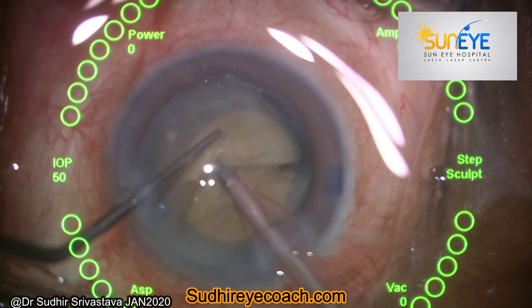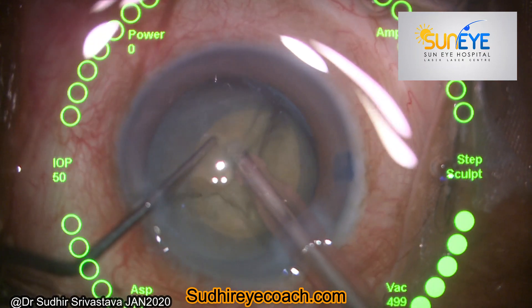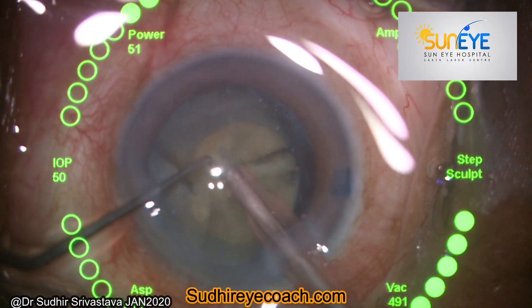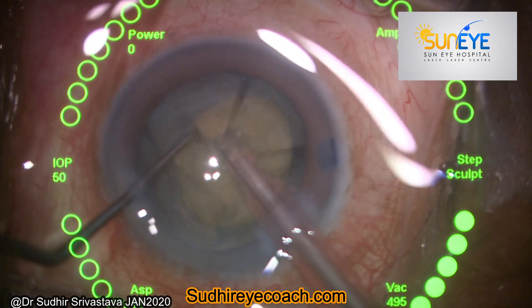For me, vertical chopping is the most trusted technique of phaco fragmentation in such cases. Always try to maintain the nucleus bulk — do not start eating the pieces immediately. Always try to hold the nucleus at places and divide it into smaller pieces.